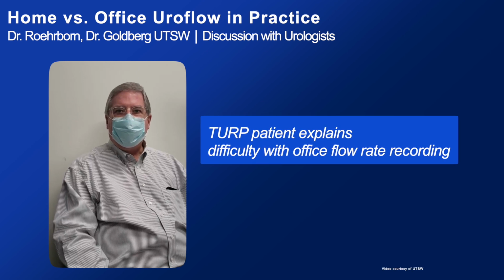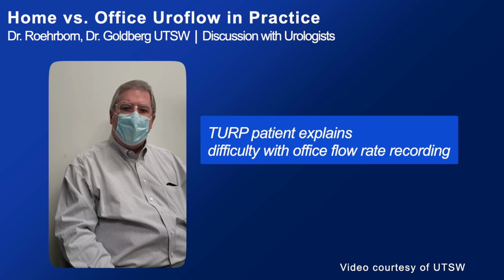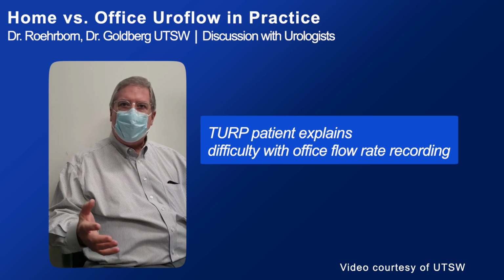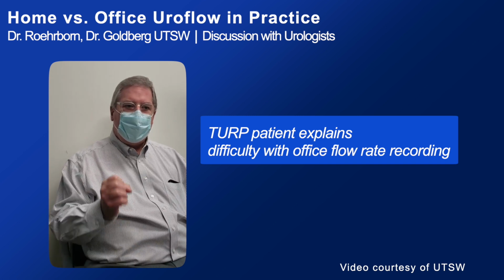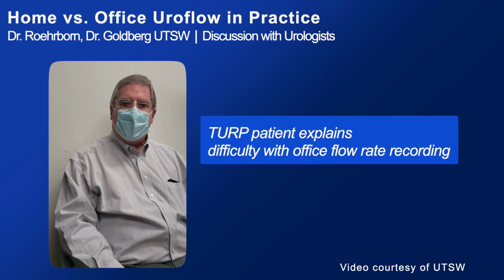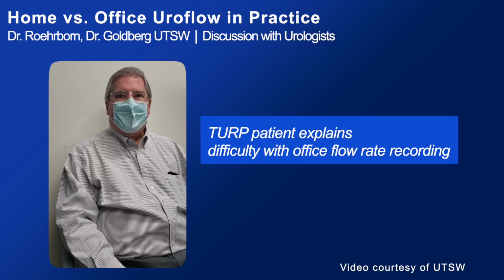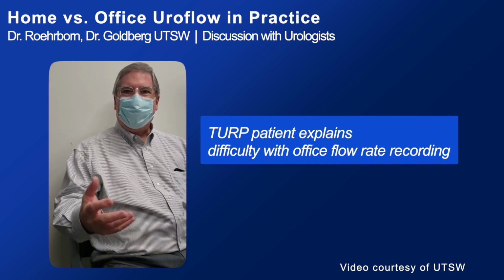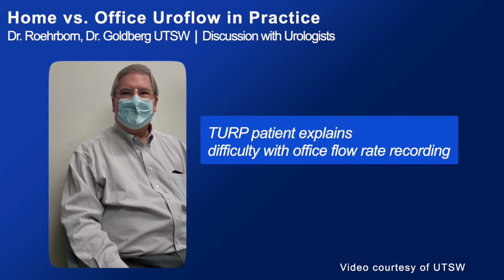I failed. This is not typical of what I have been experiencing since the surgery. And so the volume was quite low today, and at home it's usually better? Oh, yes. And the flow, you had told me after my surgery that I'd probably be urinating like a 14-year-old, and I do. I have a strong stream. It finishes. I'm pleased with my flow. All right. And so it's just in the doctor's office, the pressure and the timing isn't right and that kind of thing. I did drink liquids and such, but I'm trying to meet the deadline with you, and it just didn't work. And it's understandable, and you're not the only patient, believe me.